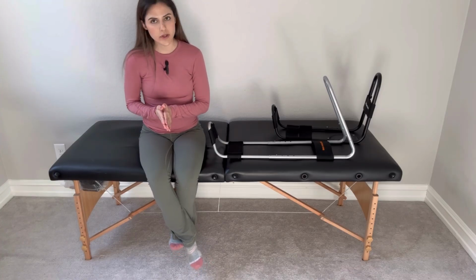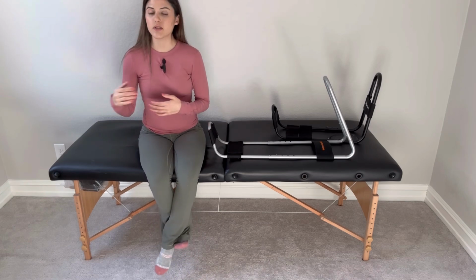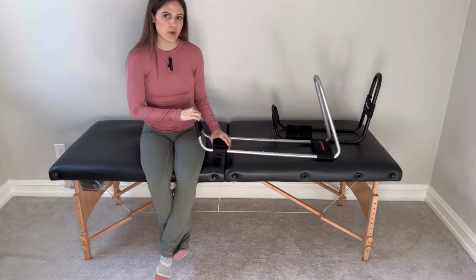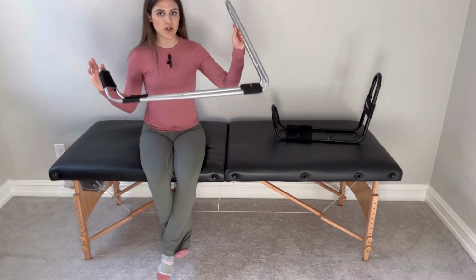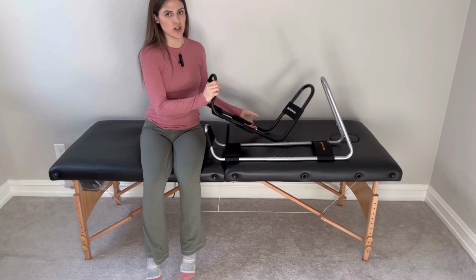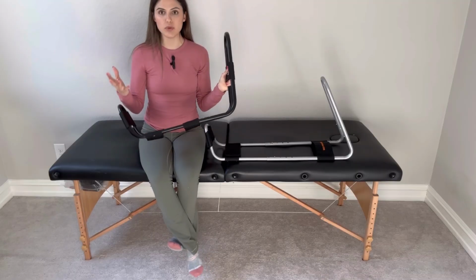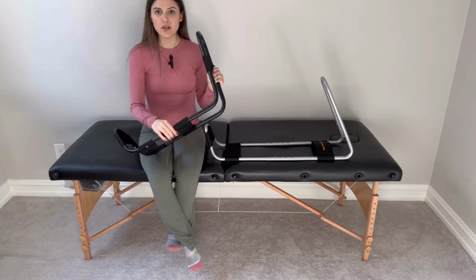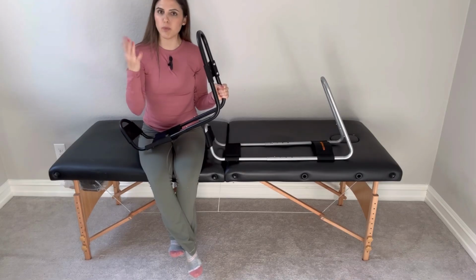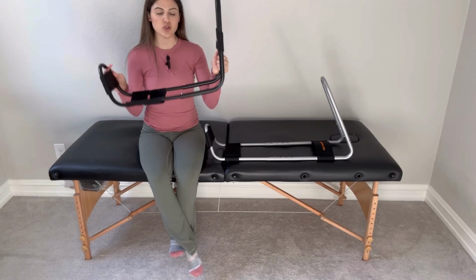Generally, you want full range of motion within 6 weeks after surgery. Of course, everybody's going to progress a little bit differently. So, I recommend these stretching devices if you're not making progress with your knee extension. You can also start to use these as soon as you are out of surgery. Some PTs will use this right out of surgery. I usually start people by week 2 post surgery. I'll start them with this stretching device.